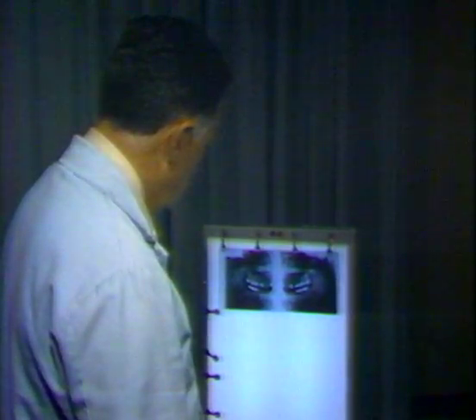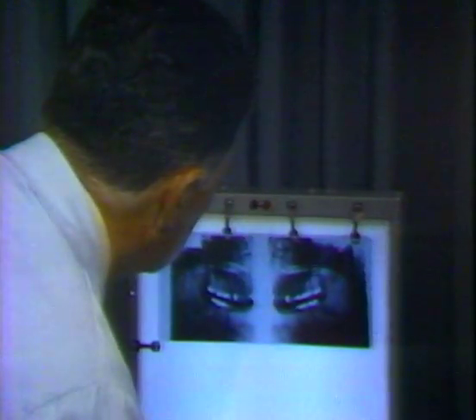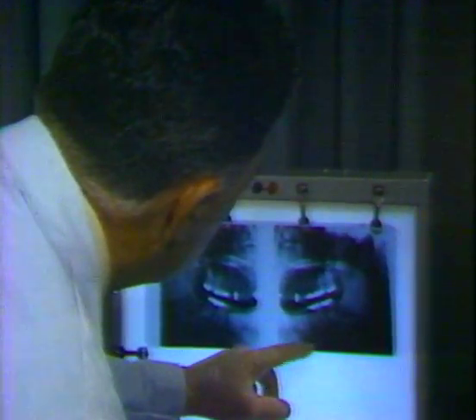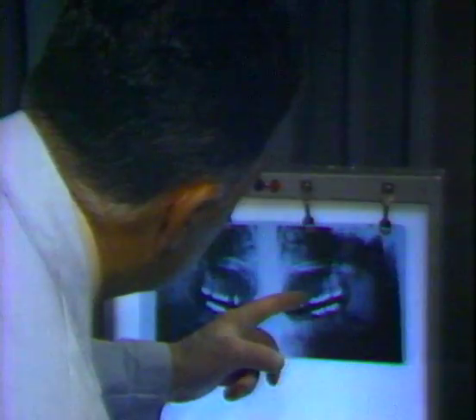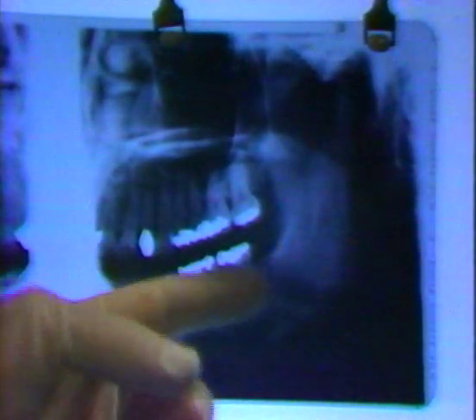Prior to starting any tooth removal procedure, it is essential that the operator visualize, from radiographs and from his knowledge of dental anatomy, the anatomy and shape of the root structures of the tooth or teeth to be removed, and the anatomy of the adjacent tissues. The operator must keep in mind the relationship of the teeth involved to the maxillary sinus, nasal fossa, the lingual nerve, the mental foramen, and the mandibular neurovascular canal.